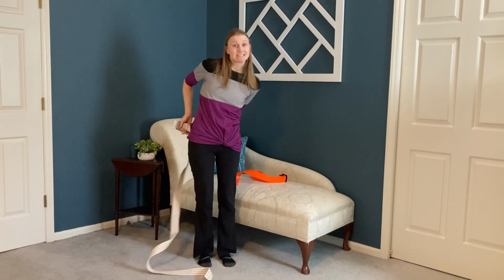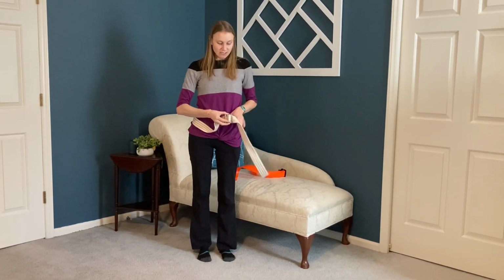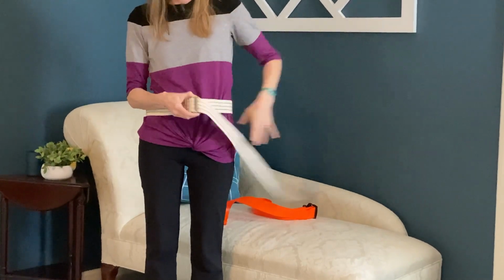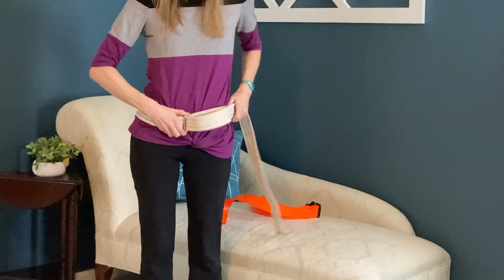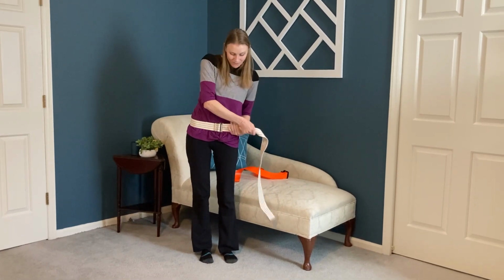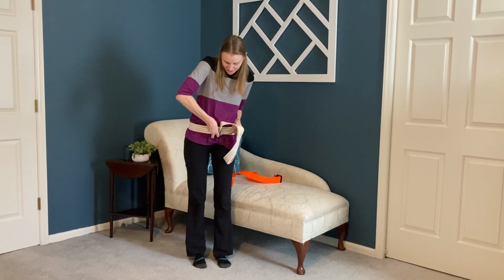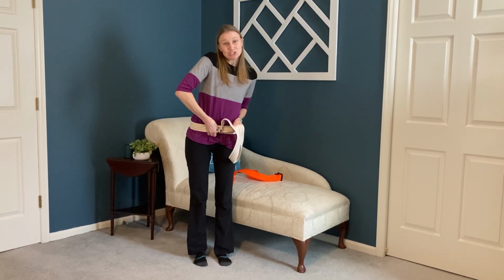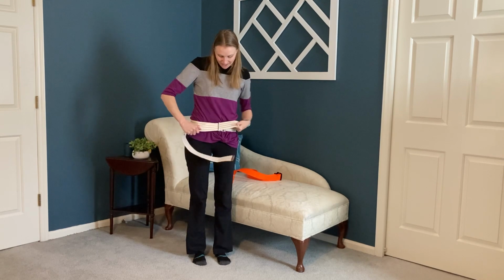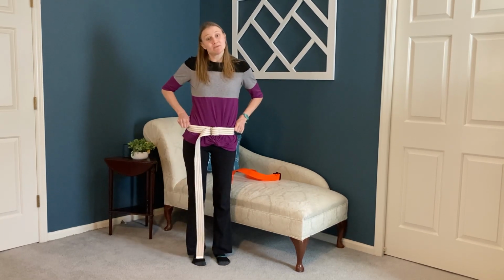To get this one tight takes a little bit of skill. So I'm going to put this on. I'm going to loop it through. You know that your teeth are facing the correct direction when the teeth on the gait belt are facing the excess strap that you are pulling through the belt. To make sure that I get this tight, I am going to get it low and tight across the hip bones. I'm going to pull this gait belt as tight as it goes while maintaining pressure this way with one hand. I'm going to take my other hand and start threading it back through the belt on the other side. The reason that I do this is if I let go of tension, the gait belt is going to be loose and I'm never going to get it tight. So while I'm keeping tension here, I'm threading that gait belt through, and I'm going to keep tension all the way through until my finger is the last thing left, and now I am left with a tight gait belt.